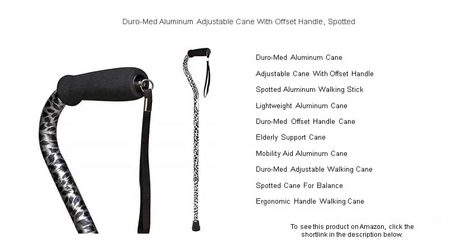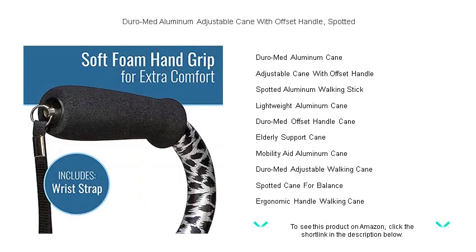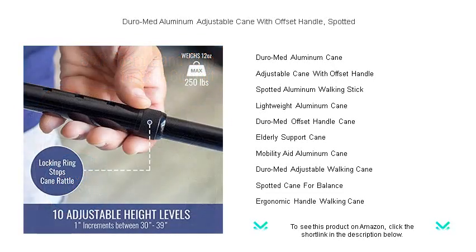Experience stability, comfort, and style with the Duro-Med aluminum adjustable cane with offset handle in a chic spotted design. Specially crafted for individuals who require a little extra support while walking, this lightweight aluminum cane promises both durability and convenience.